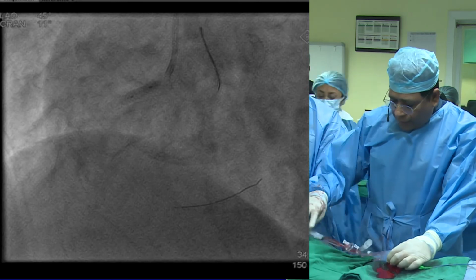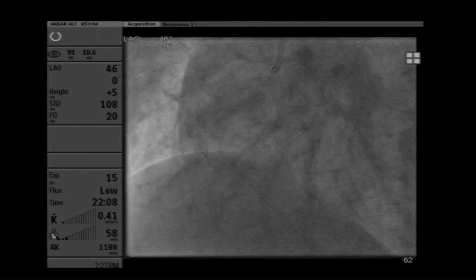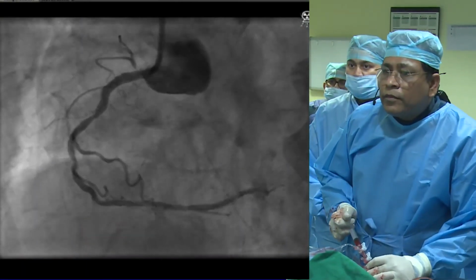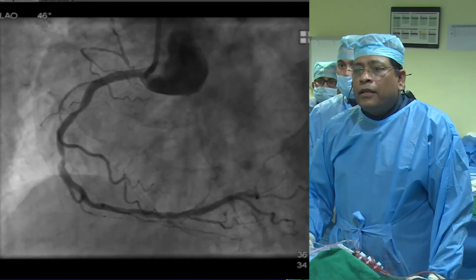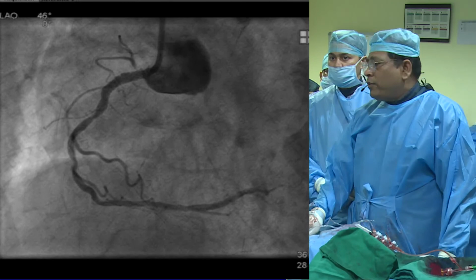So we are done now, and we can have a final IVUS look, and we'll do a FFR now. So FFR wire looks damaged, and there is a little challenge in the. So we'll take a final view and we'll come up. Okay. One injection of LAD and one injection of RCA should be more than enough. Oh, looking fantastic. Hold it. So that area we have seen in the IVUS, that there was you see here now in different frames. I'm happy with the result.